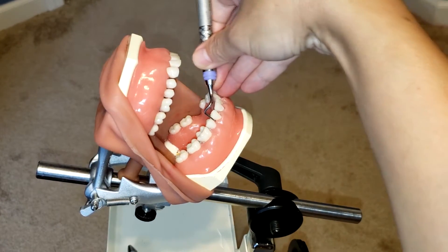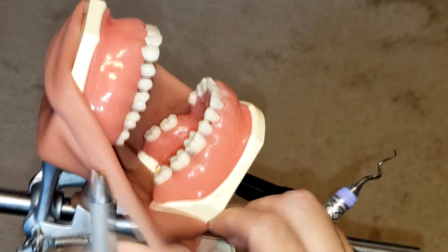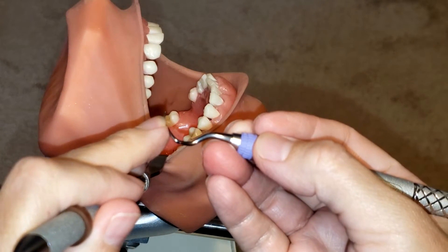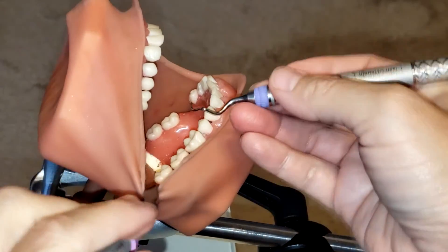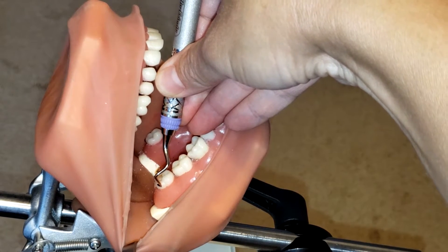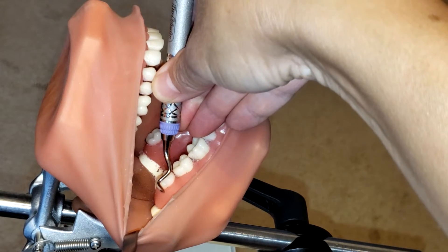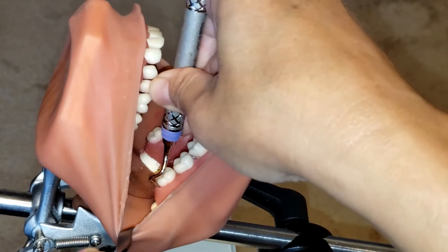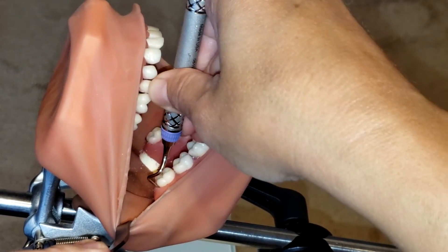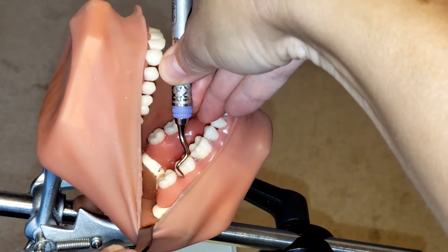So again, this is the correct working end, and I'm going to show you how to use it on these posterior teeth. First, you want to make sure that you use the toe-third of the instrument — the toe-third has to be adapted to the tooth at all times. You're going to start at the distal line angle and work your way down into the pocket. Insert at zero degrees, go in, and establish a 70 to 80-degree angulation so that you can remove the calculus. Rock on your fulcrum, then come out again.